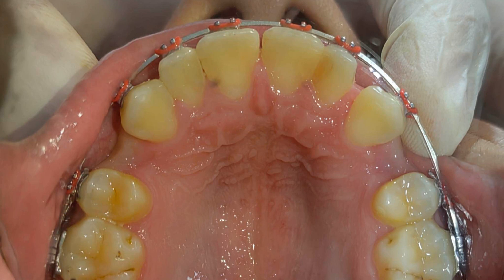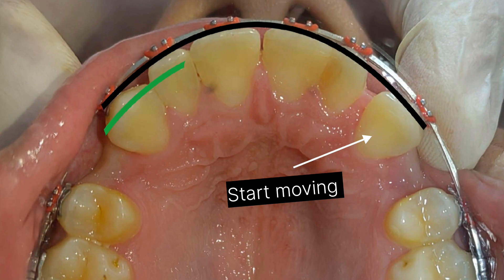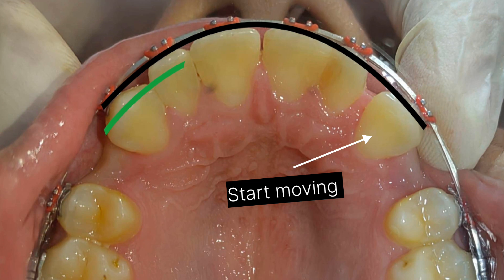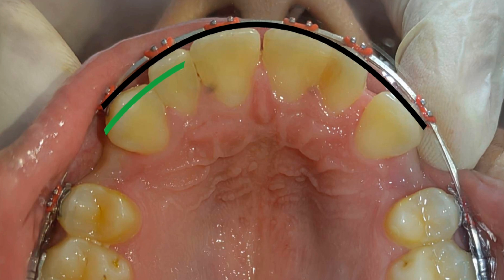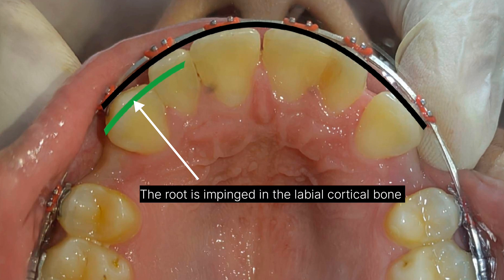In the next visit I found that the canine on the left side started moving, but on the right side it didn't move. I started an examination to find the cause, and the problem was in the labio-palatal inclination of this canine. The root of this canine was embedded in the labial cortical bone, so its movement is very difficult.